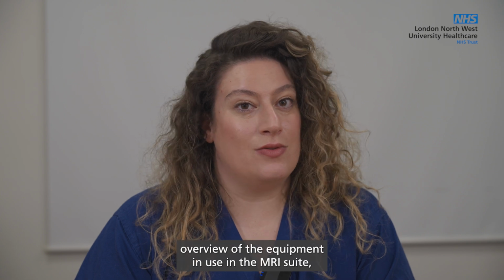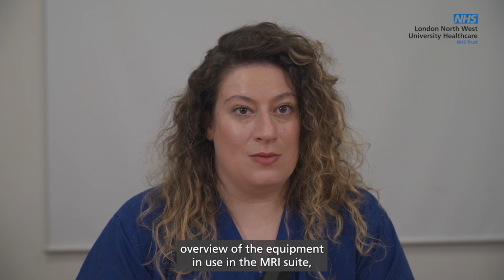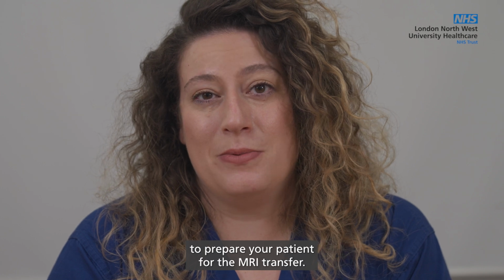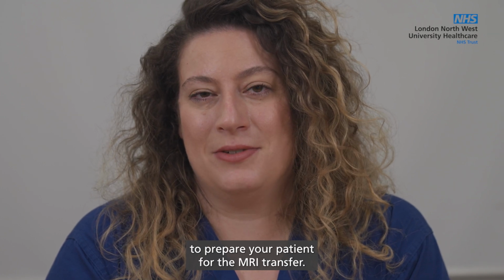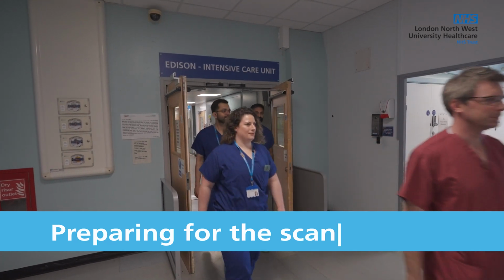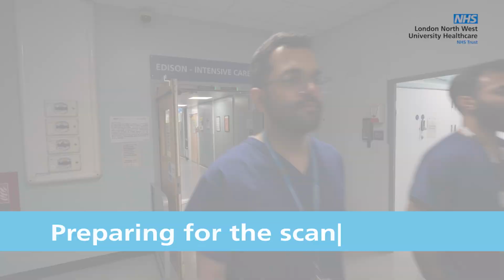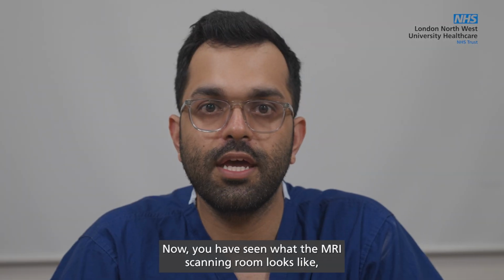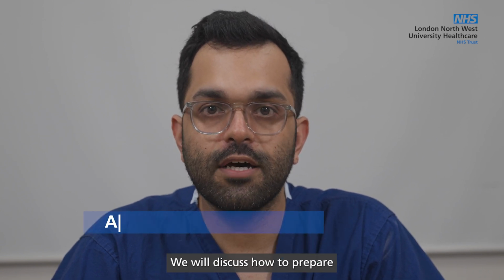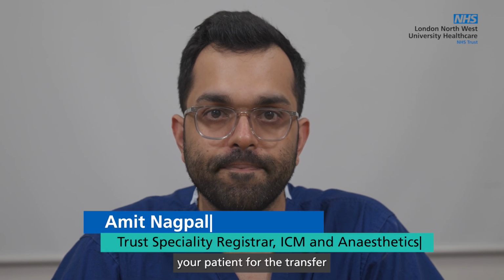This concludes our overview of the equipment in use in the MRI suite. I will now hand over to my colleague who will discuss how to prepare your patient for the MRI transfer. Now you have seen what the MRI scanning room looks like and have an idea of the equipment you'll be using. We'll discuss how to prepare your patient for the transfer.